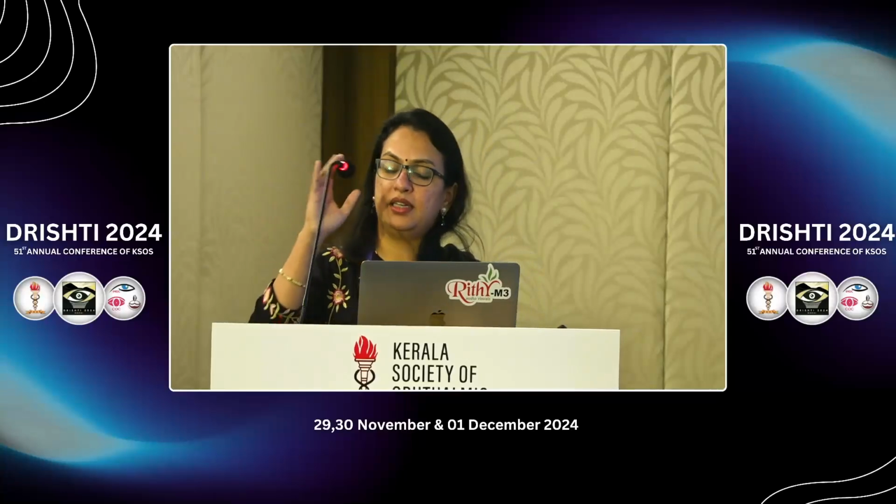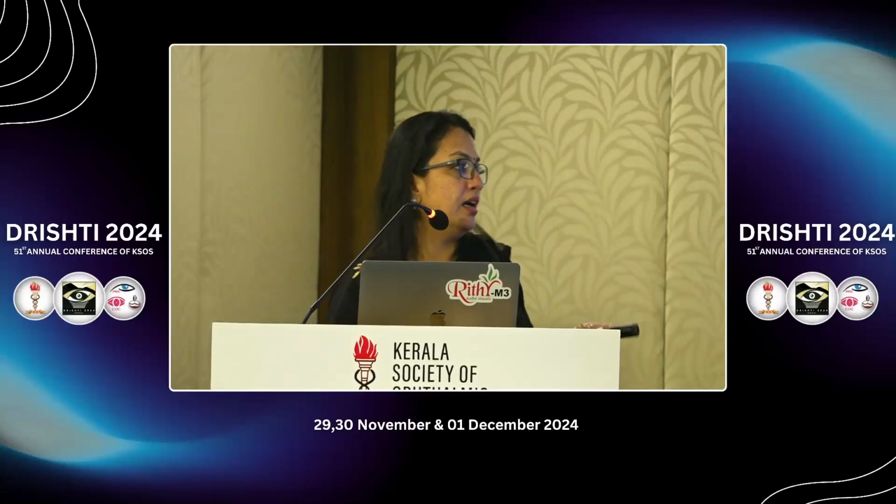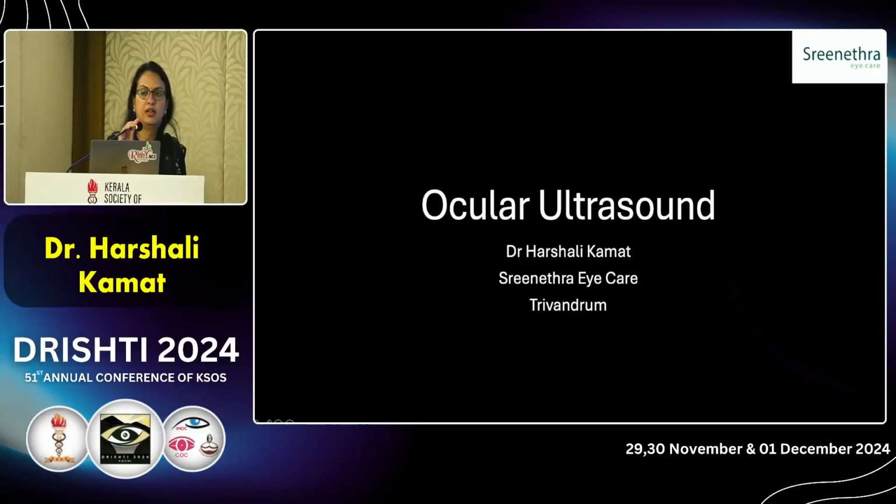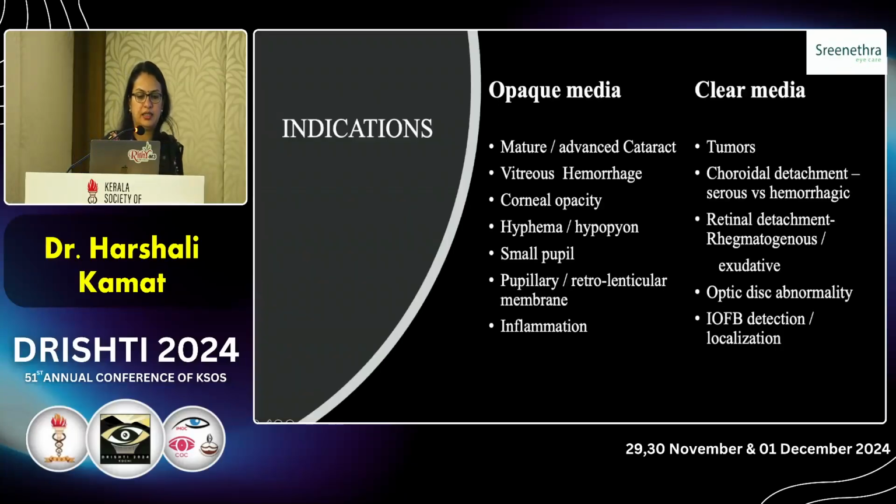Good morning, everybody. I'm Dr. Harshali. As Dr. Sharath was asking, are these imaging still relevant? I think ocular ultrasound still plays a very important and relevant role even in a general ophthalmology clinic. I won't go into the physics because of the paucity of time and will lay more stress on the pattern identification of different conditions and the techniques involved.